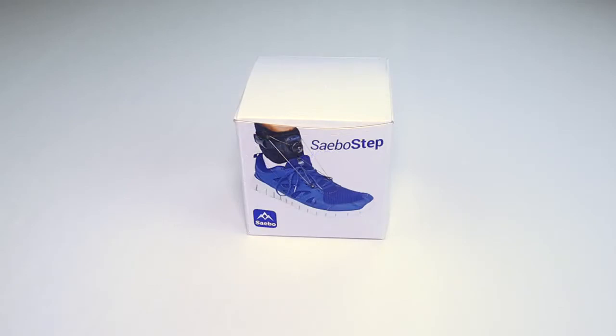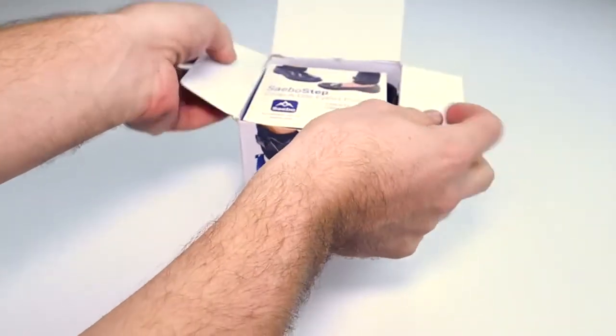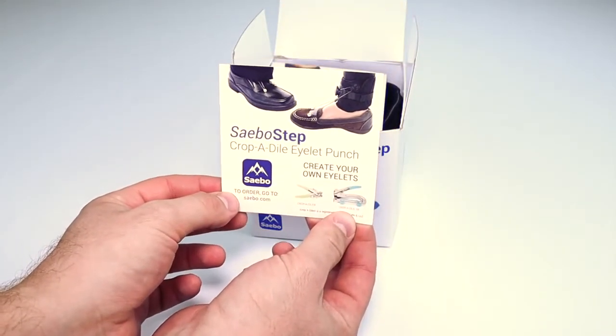When you receive your Sabo Step, it comes in this box. When you first open your box, you'll be met with a card mentioning the crop-o-dial. This is an all-in-one tool allowing you to use the Sabo Step on any type of shoe.